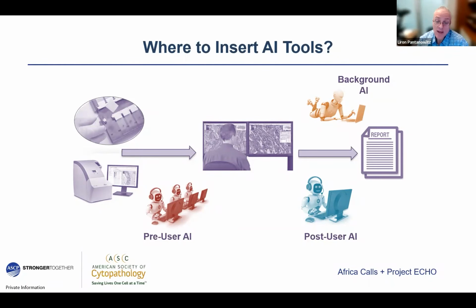That's exactly what academic medical centers do, where they have registrars, residents, fellows, they prepare a report. The AI could do all of that, what I call a digital fellow. So it would prepare everything for you like a resident, registrar, fellow would, but at the end of the year, the trainee doesn't graduate, the AI only gets better year after year.